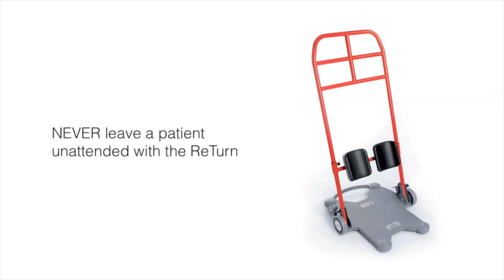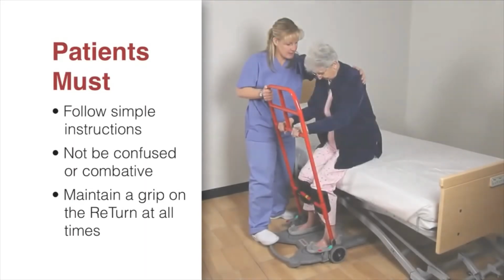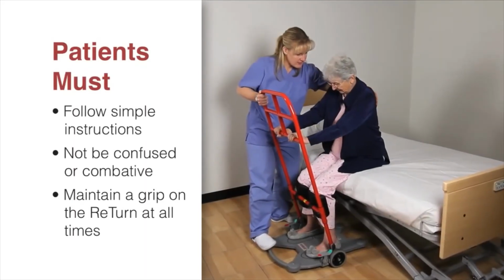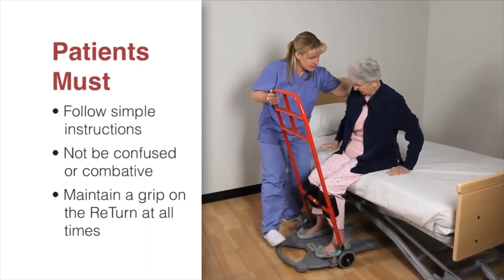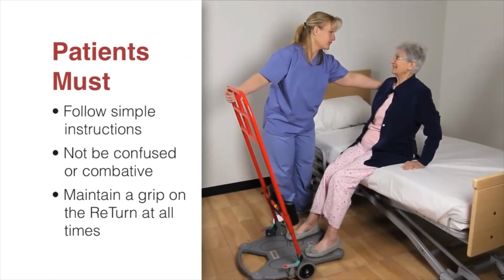It is important to never leave the patient unattended when on the return. Never leave the return in reach of a patient while the patient is unattended. Patients must be able to follow simple instructions, not be confused or combative when using the return. It is important for the patient to maintain a grip on the return at all times.